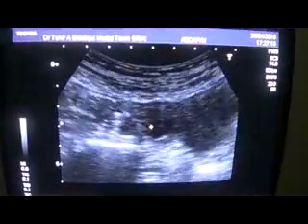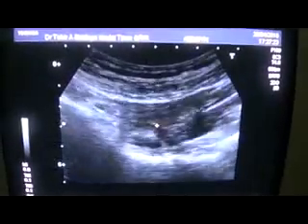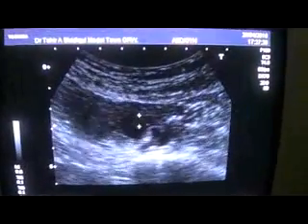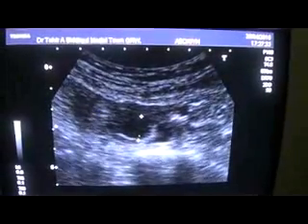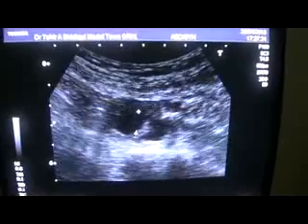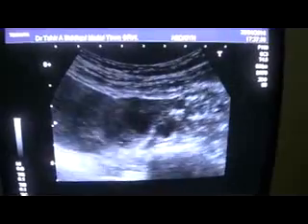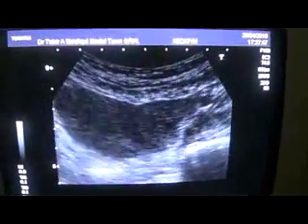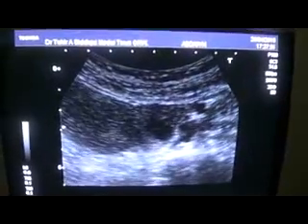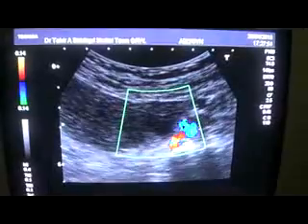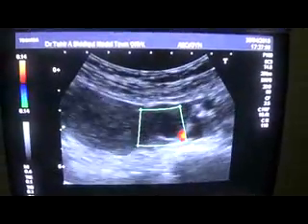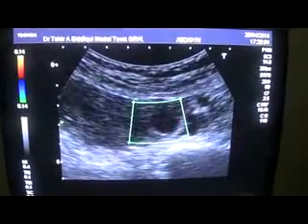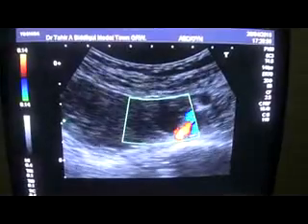It has a thin capsule around it and it measures approximately 11.1 mm. With the positive pregnancy test and raised beta-HCG levels, this is a deformed sac — an extrauterine deformed sac which is concealed by the bleed around.